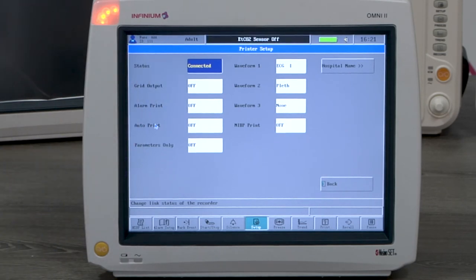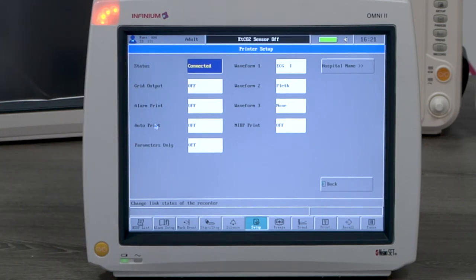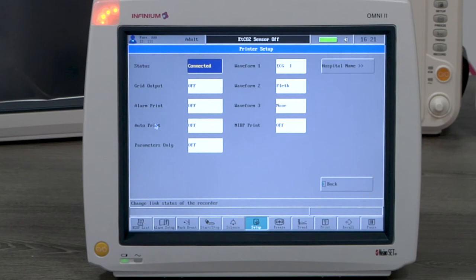All options will be available. When there is no printer installed, the status will be disconnected and no option will be available.